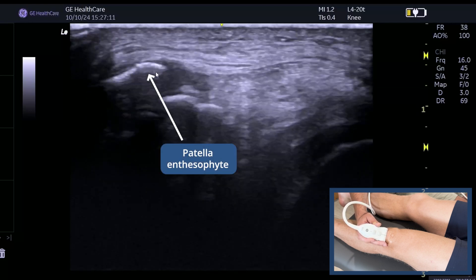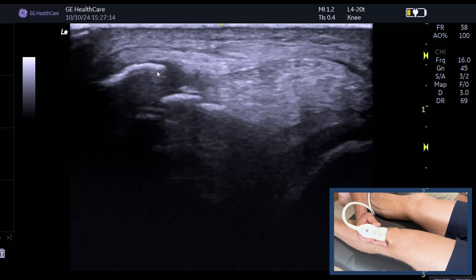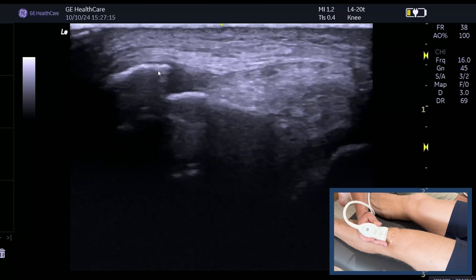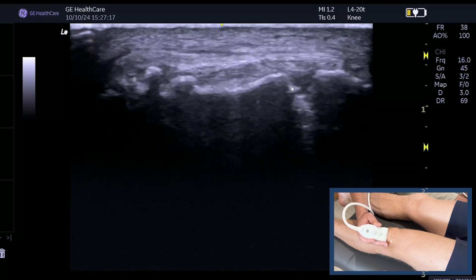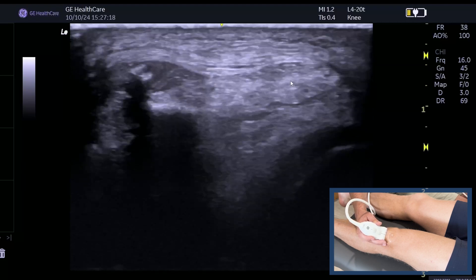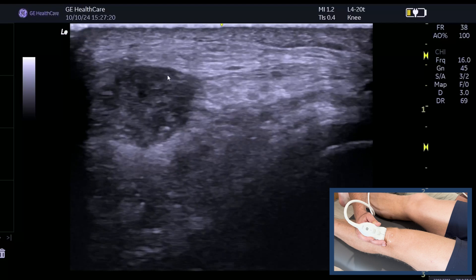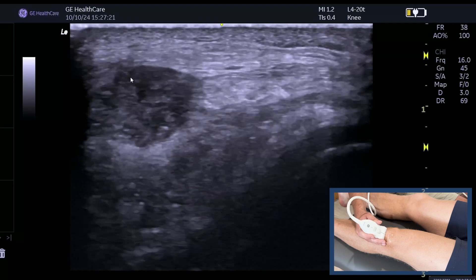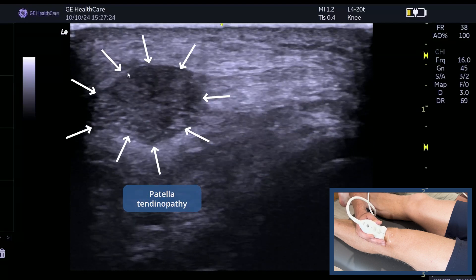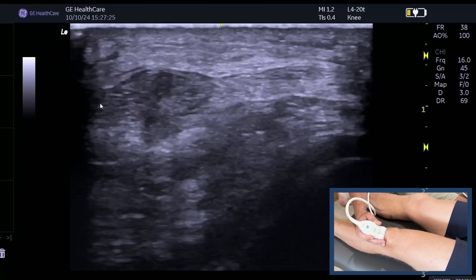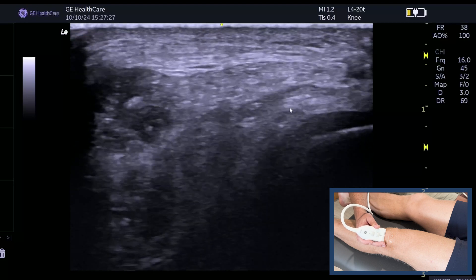It's important to differentiate between an enthesophyte and a calcification within the tendon — we'll go on to that. You can see there's the bipartite. This is the patellar tendon in transverse, and you can see on this medial side there's some significant tendinopathic change. This part of the tendon looks really good.